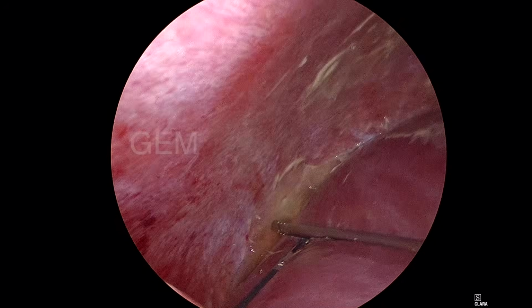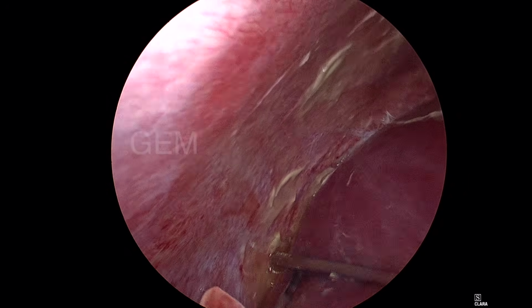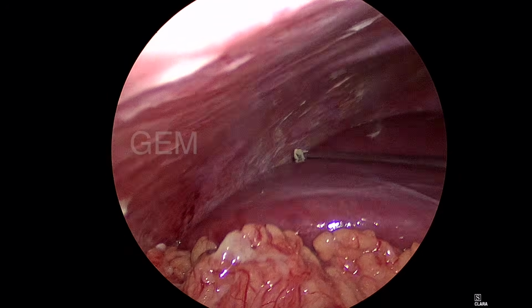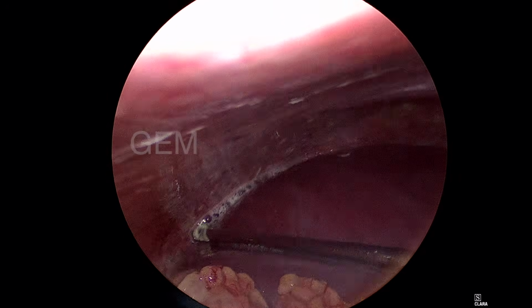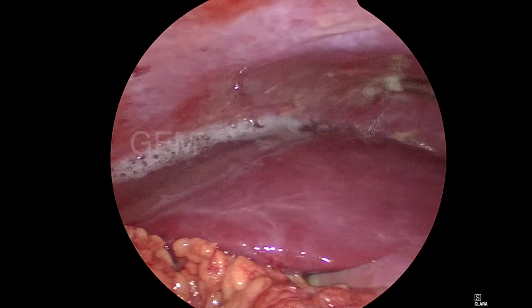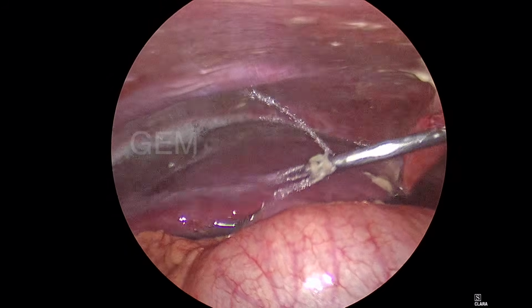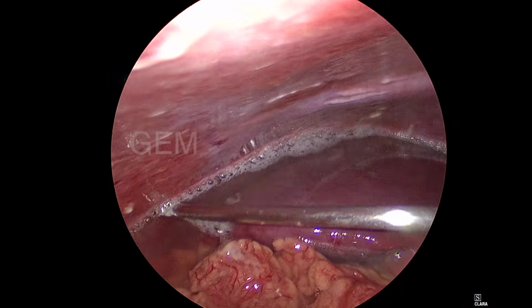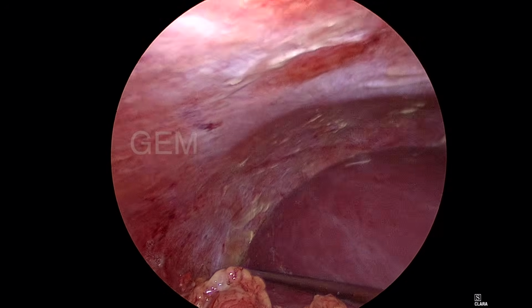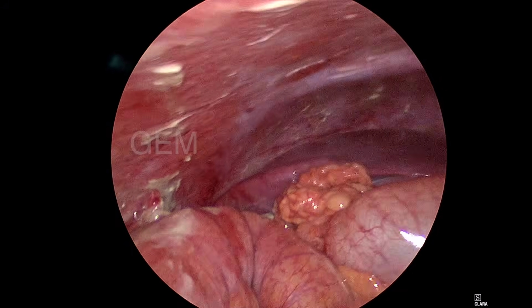These also produce some pleural effusion in some patients. Because of the pain, they won't breathe well, and then atelectasis, so the hospital stay will increase, and fever, antibiotics, so many things. If you give a thorough wash, the entire bacterial load will be cleared, and the peritoneum will take care of the remaining bacteria. Anyway, the source is removed, and the recovery will be fast. I used to keep the patient only 1 day after the surgery. Once the bowel starts functioning, I will discharge the patient.